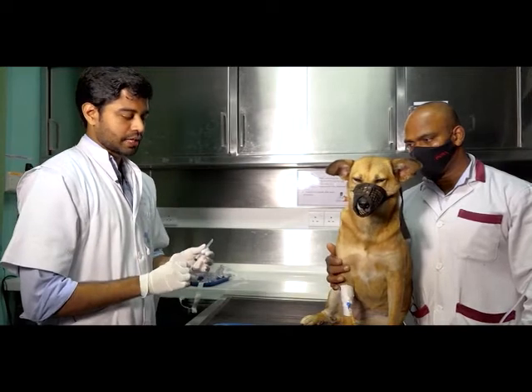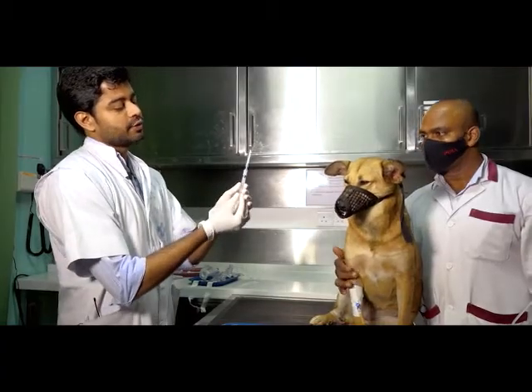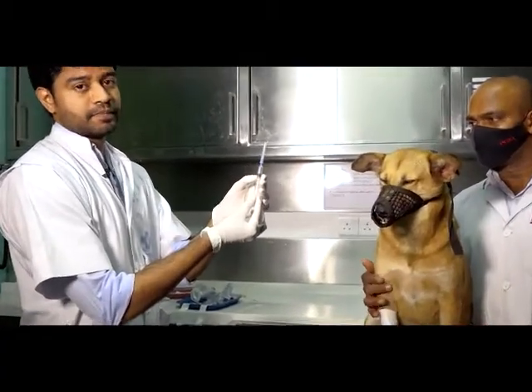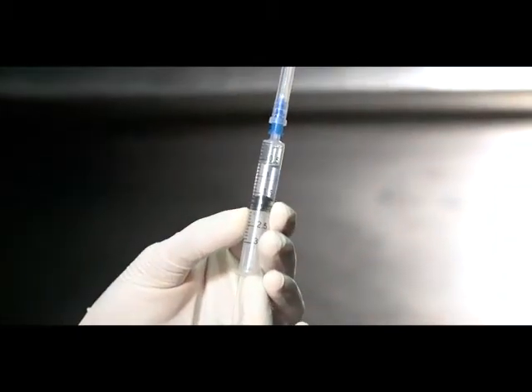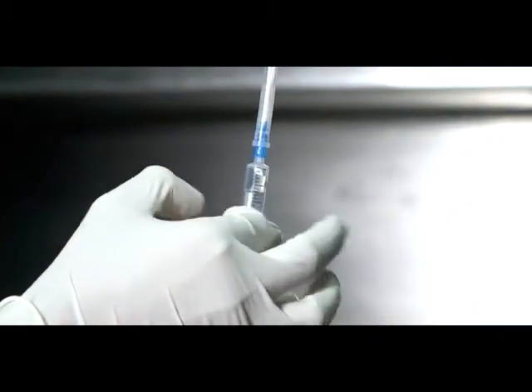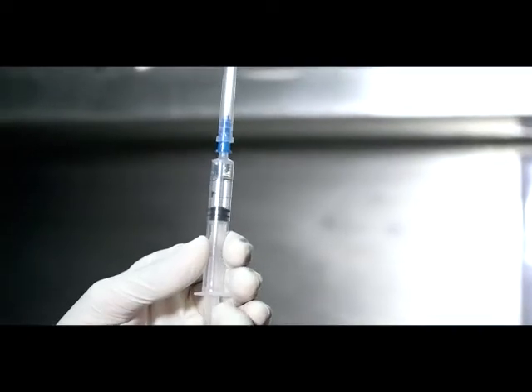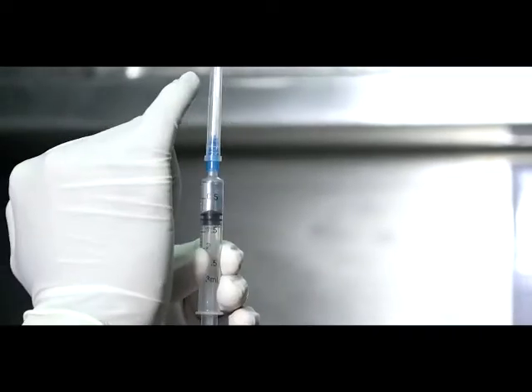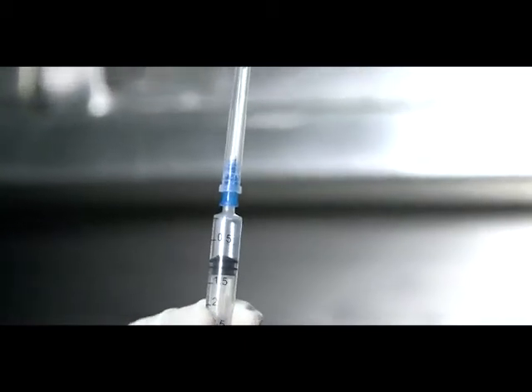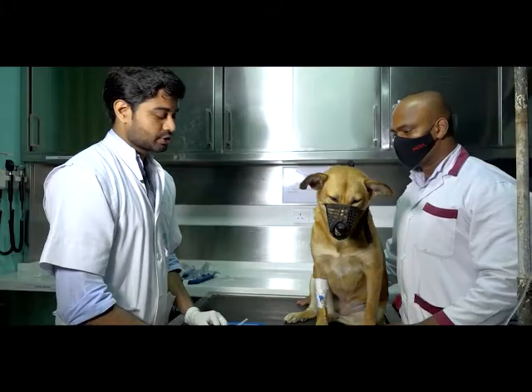The important thing about IV drug administration is that you avoid air bubbles in the syringe. So if you have air bubbles, there are few inside, as you can see. So you have to get rid of them. What you could do is you could just gently pull it down, give a nice tap to it, so we are getting rid of all the air bubbles, and then gently press it up, and you have to make sure that small bleb comes on the tip of the needle, so there's no air inside.